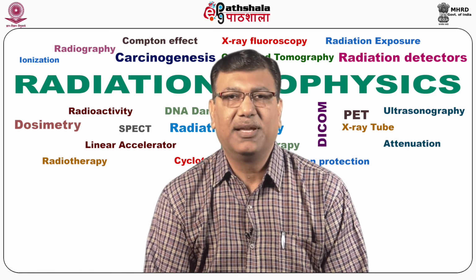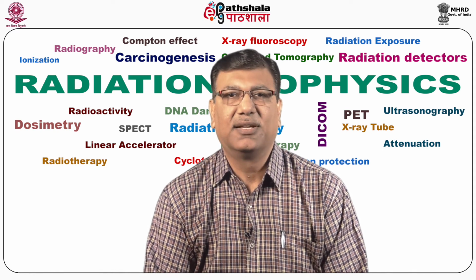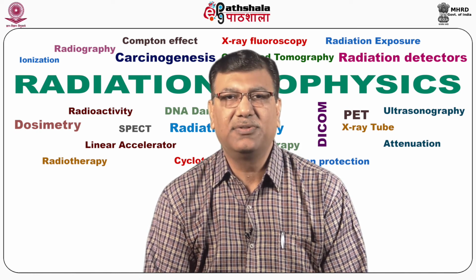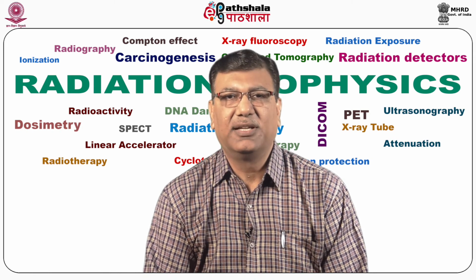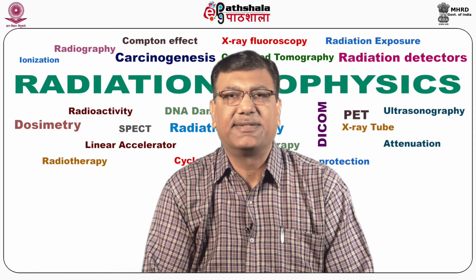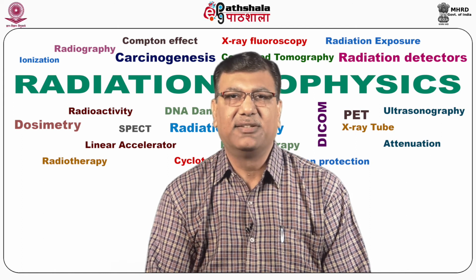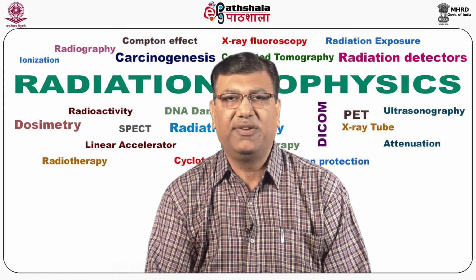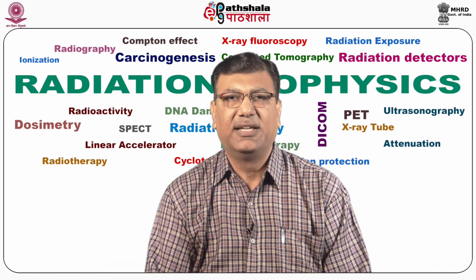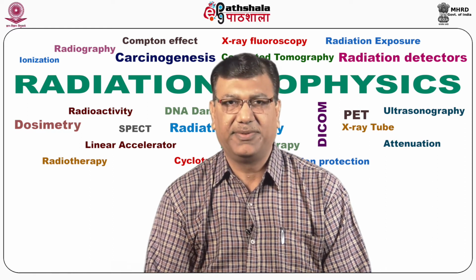Due to its big size, there is a penumbra. Penumbra is the word used for the radiation given to the region outside the region of interest. This is the region where we do not want to deliver dose, but due to the finite size of the source, the dose is delivered in that area, and that is the drawback of the Cobalt machine.